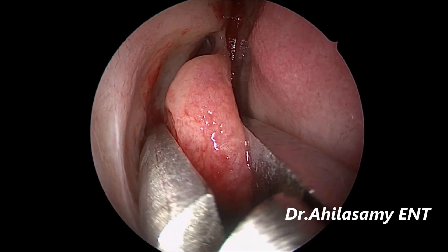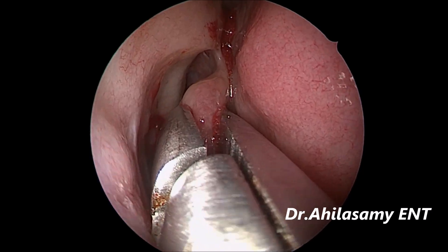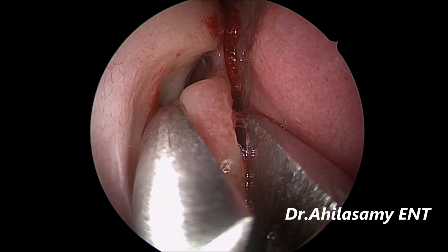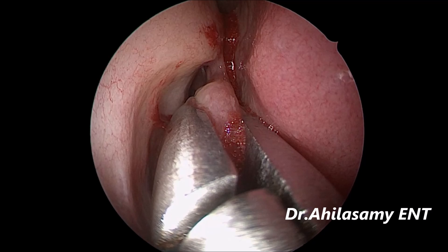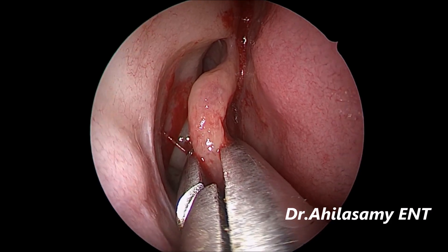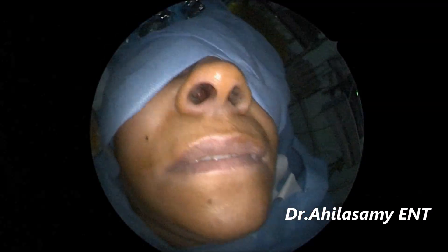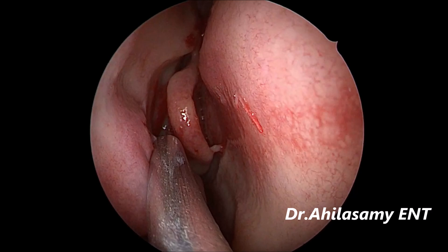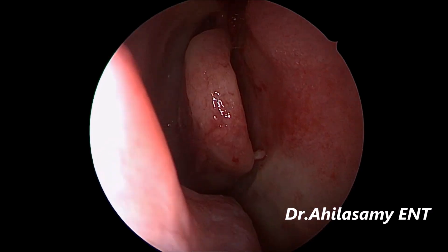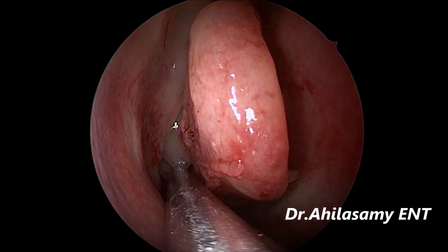Before crushing you couldn't see the middle meatal space. Now after crushing you should have a good look at the space — a good space in the middle meatus to work. You should see completely the uncinate and the part of the bulla which comes out. Gently crush — do not damage the mucosa. Patients are very comfortable under local anesthesia with good IV sedation of fentanyl and dexmedetomidine. See, the uncinate is fully visible and the bulla is also seen. It has now become like a normal middle turbinate.